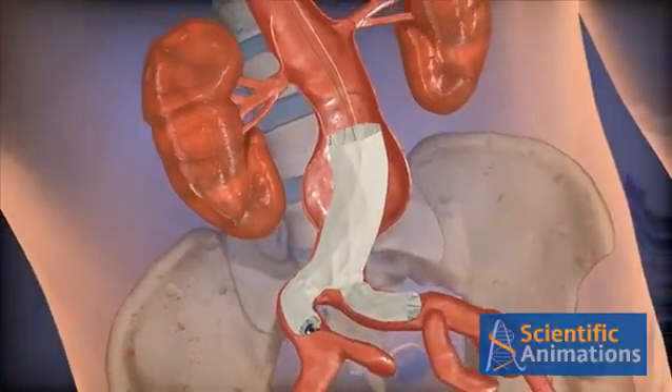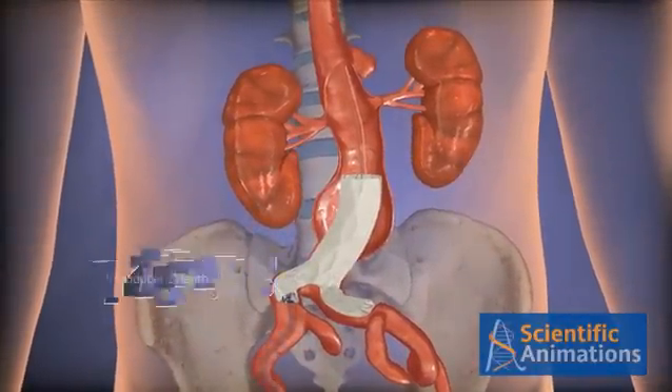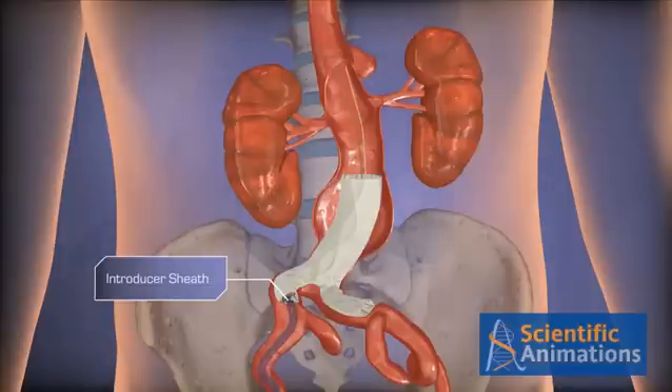Maintaining introducer sheath position, remove the inner core completely and tighten the hemostasis valve. Now, you're ready to advance the accessory system if necessary.